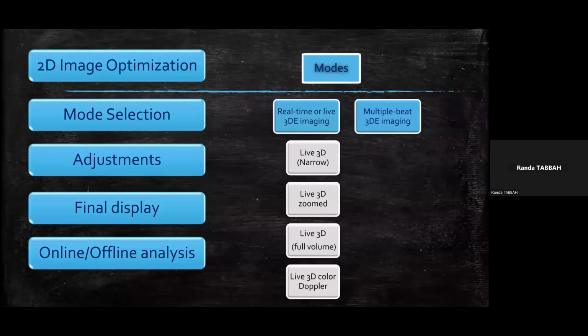So we have several modes in 3D. We have the real-time or live 3D images, so we can use 3D while we are seeing all the images.